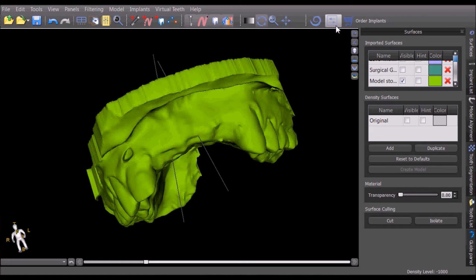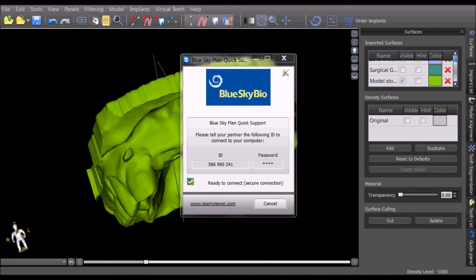The new button on the horizontal toolbar will automatically launch the TeamViewer Quick Support module. Simply enter the dentist's ID number that appears on their screen and the built-in hardwired password BSP into your installed version of TeamViewer on your computer.